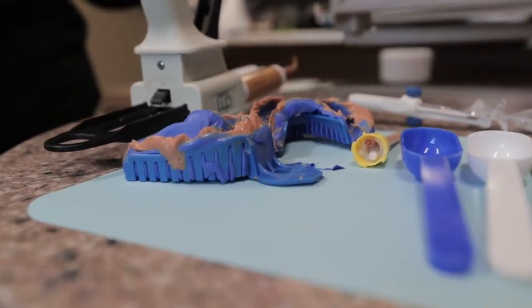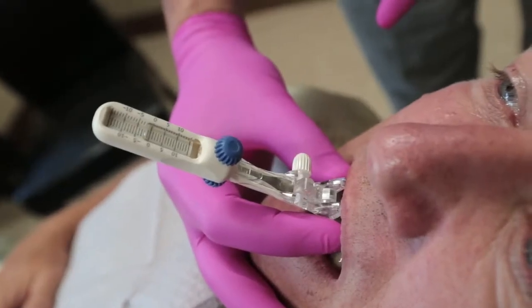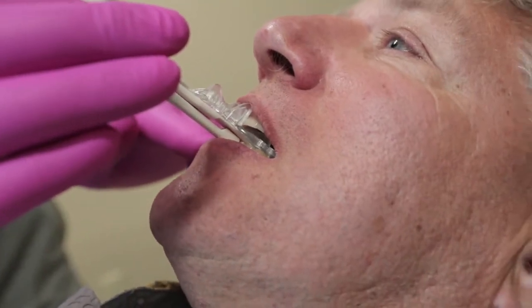We're going to record digitally or physically master impressions of the maxillary arch and of the mandibular arch. The only thing that's going to be new to you, if you've not done this much or at all, is you're going to use a SOM gauge, and that's going to help you record a bite registration. We want our patients in a protruded position — this is a mandibular advancement oral device. If we pull their mandible forward at night when they're lying down and sleeping, it's going to drag their soft tissues away and help keep their airway open.